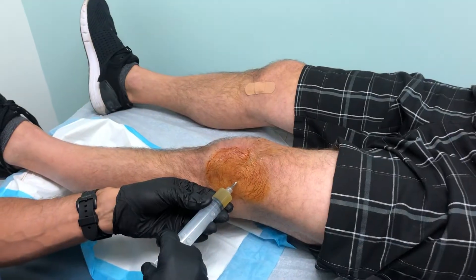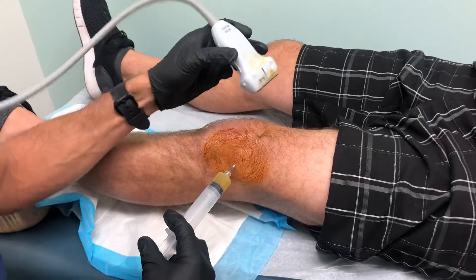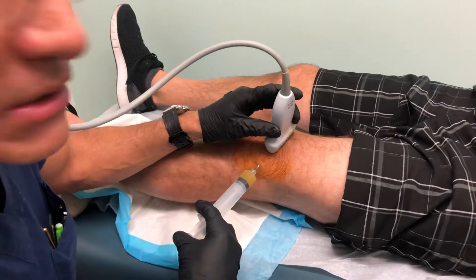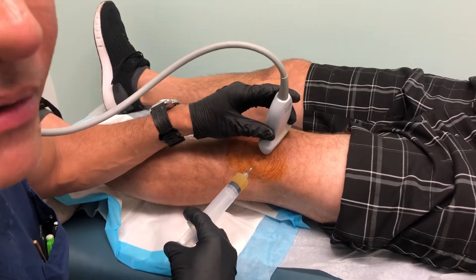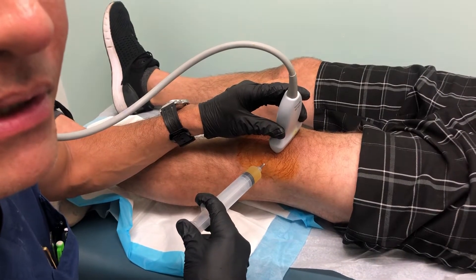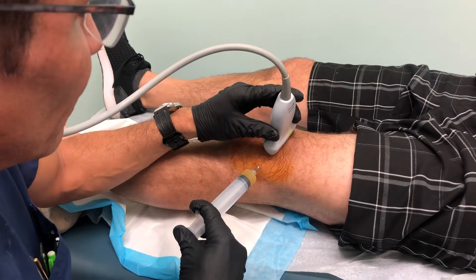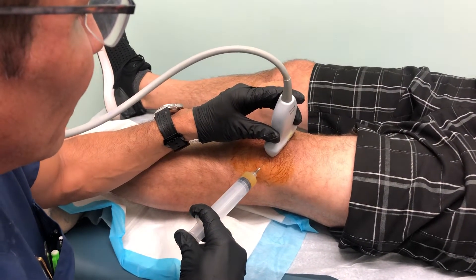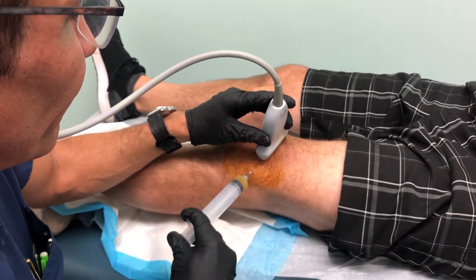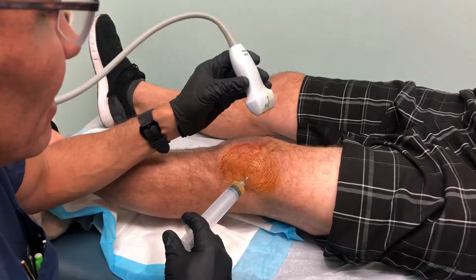Since he feels it, I'm going to move the needle a little bit because it might be near some soft tissue — that's basically what that tells me. There's my needle again. How about there? See, now I'm making sure I'm keeping my spot there. We're going to put about five cc's in here. That's in the joint.